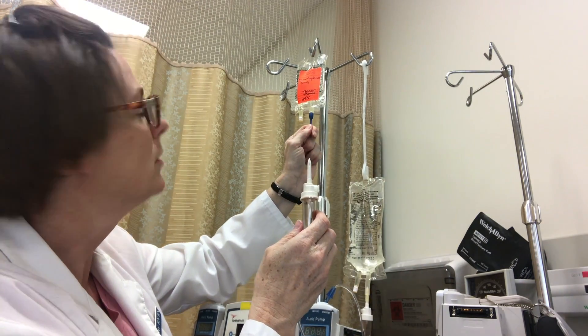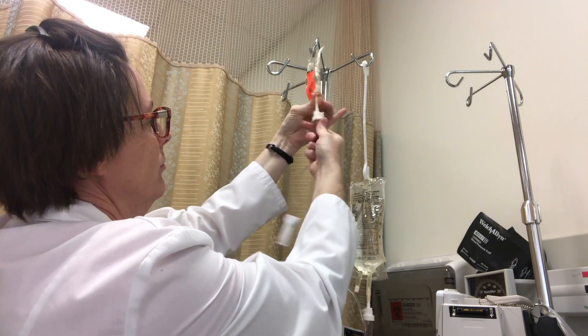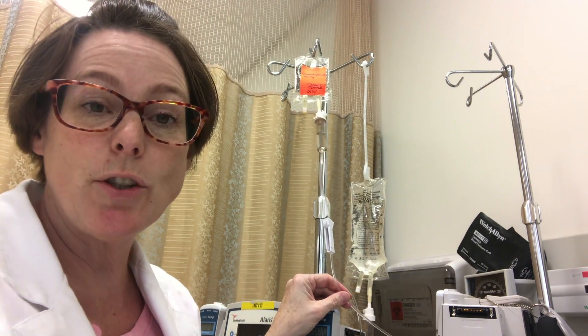Now this has a protector sheath as well — we're going to take that off. We're going to pull on our blue cap, secure and insert, and then all that's left to do is program the pump.